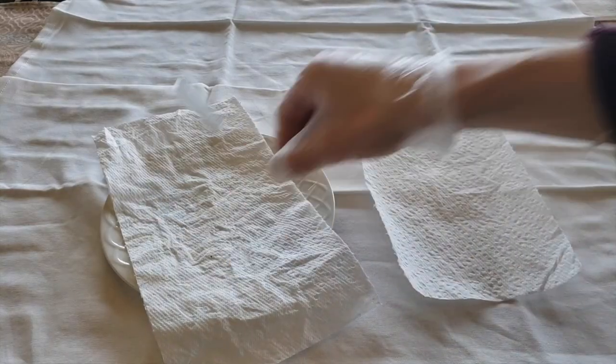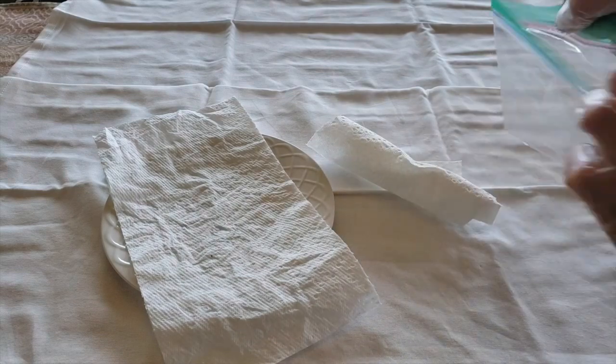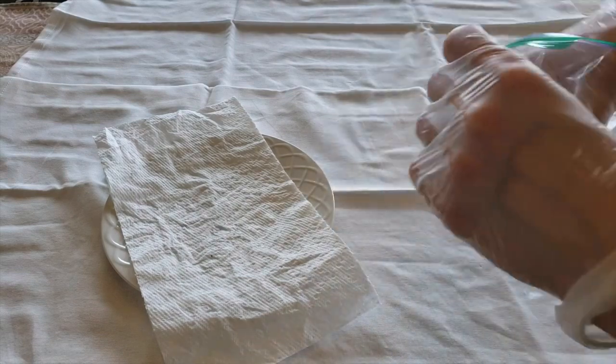When the items are dry, carefully wrap them in a clean paper towel. Place the clean brush in a plastic zip-top bag and store it away for future use.